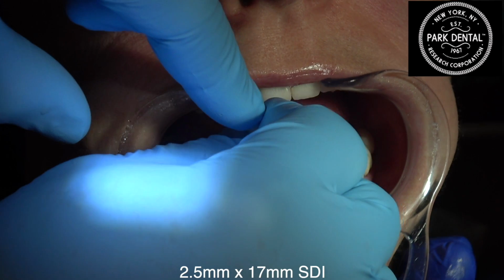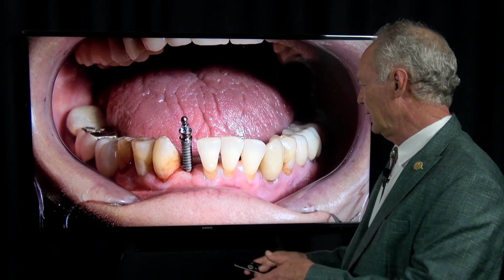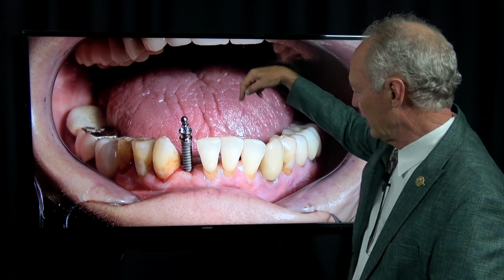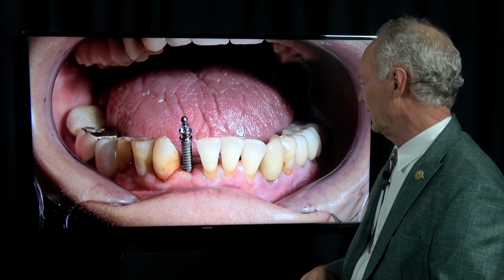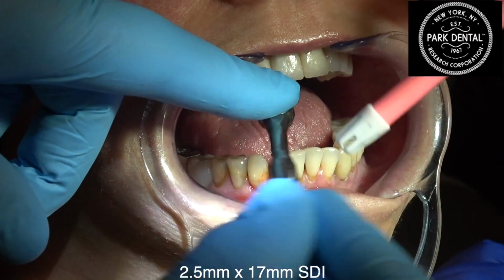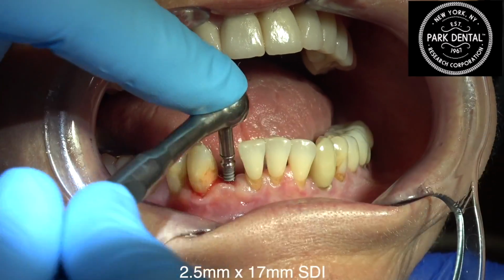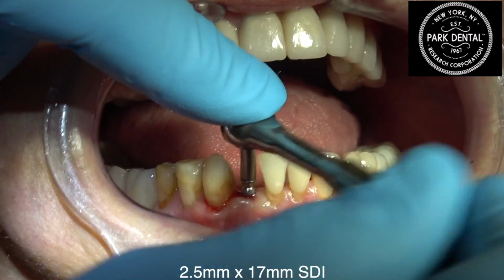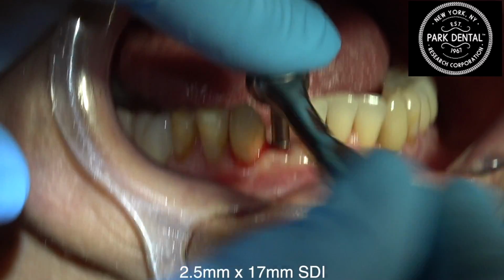So this is a 17 millimeter small diameter implant. You don't have to drill all the way to depth, but you want enough depth that the implant has a channel. If you haven't drilled all the way, it will advance itself in the apical part of the alveolar process to depth. This is a 2.5 times 17, and I'm going to advance it for a while. Then I'm going to take this wrench off and look at it from the incisal. It should be just fine because I have the channel that I'm screwing it into to guide it.